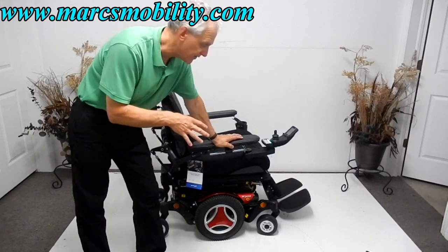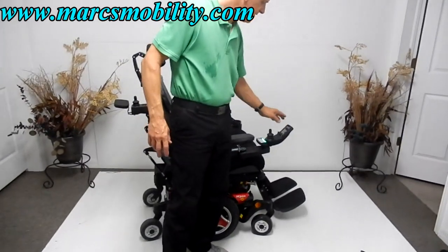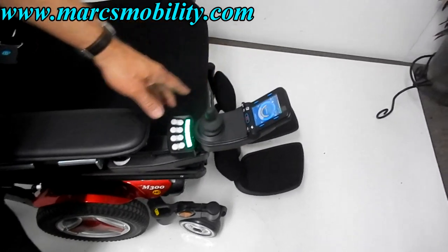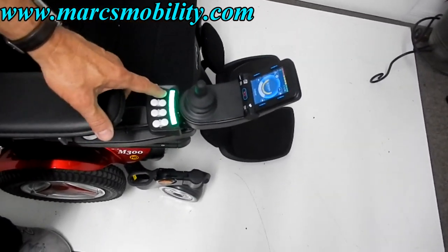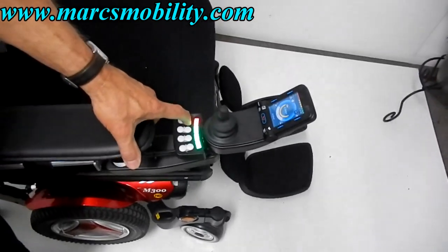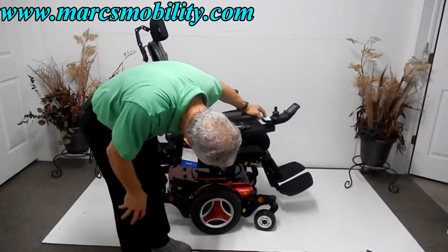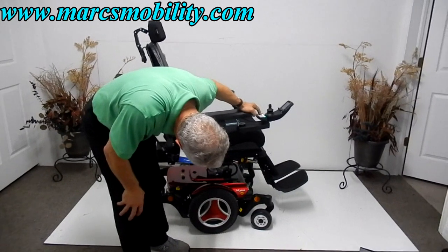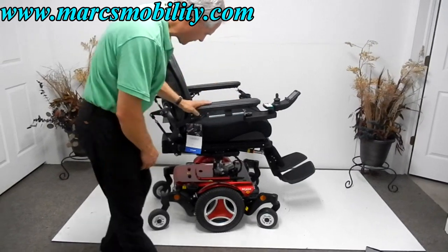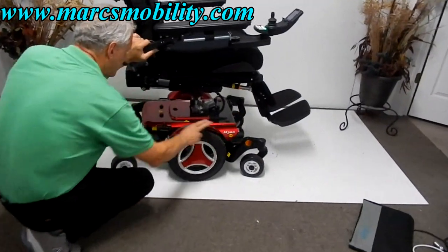The first thing I'm going to show you is that you can work all the functions through the joystick — this is the new electronics. Here's the switch box I use all the time. I'm going to go up right now so the seat is going up. You have an 8-inch seat lift going up — beautiful color too.